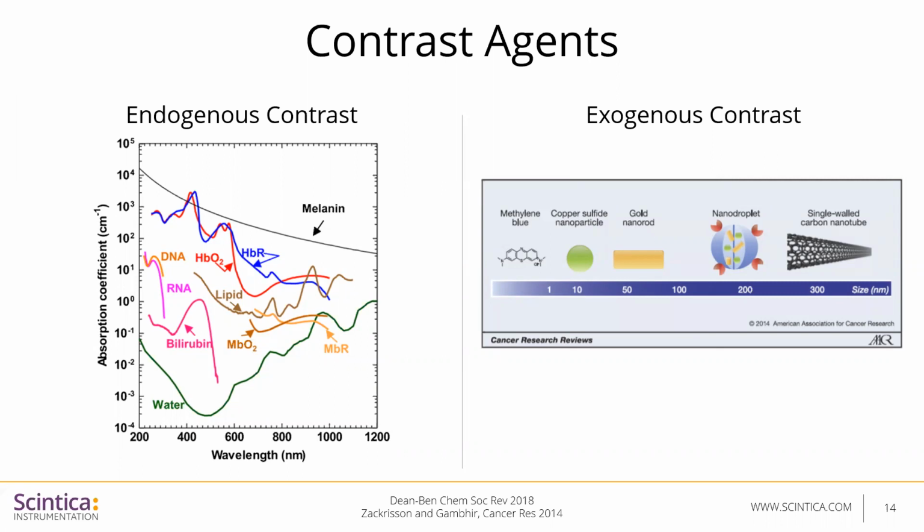But overall, the contrast agents that can be used could be the endogenous contrast or exogenous, and within exogenous, these contrast agents could be targeted or non-targeted.